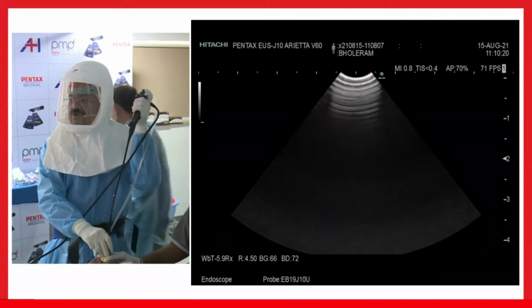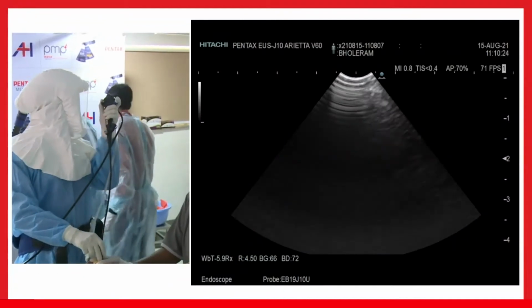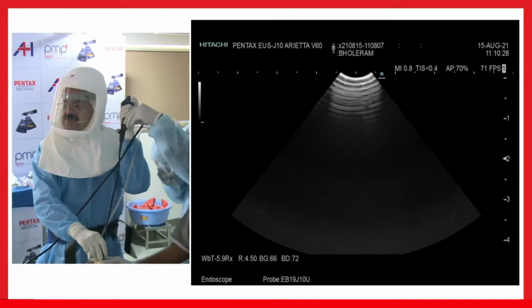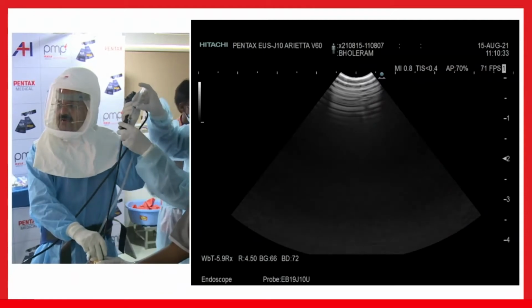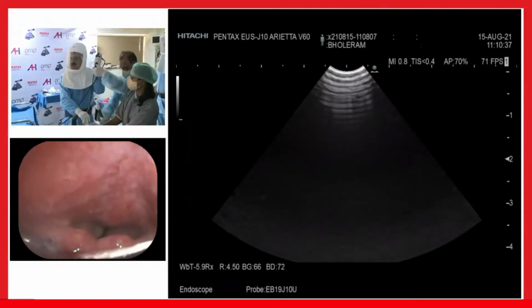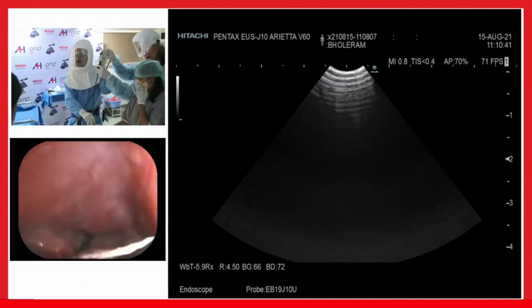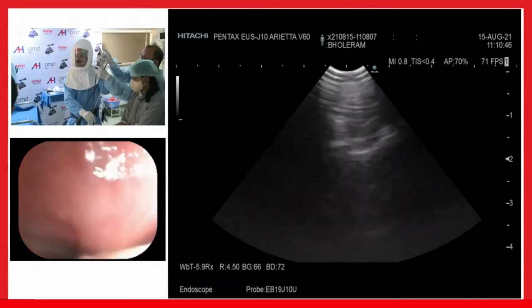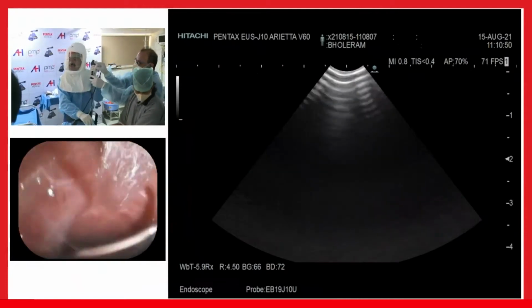The same technique, put xylocaine 2% or 1% to look for local anesthesia to anesthetize the vocal cord. And the same way as we pass the bronchoscope, here is a little bit of difference. Just look at the anterior commissure of the vocal cords and slide down, and you enter the trachea. These are the tracheal rings.